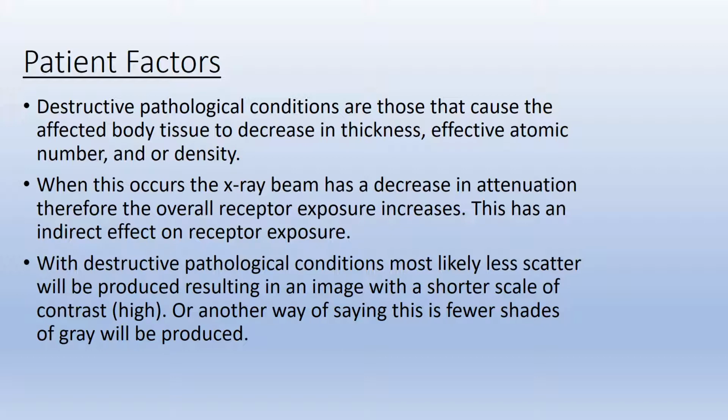With destructive pathological conditions, most likely less scatter will be produced, resulting in an image with a shorter scale of contrast or high contrast. Or another way of saying this is fewer shades of gray will be produced.